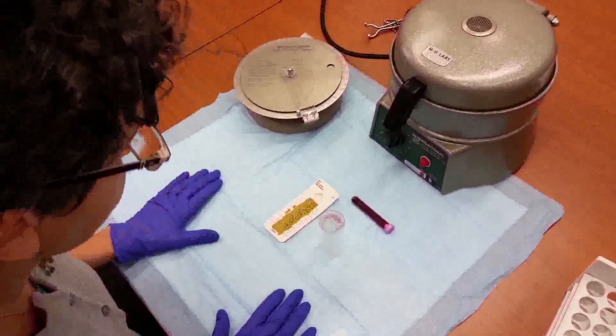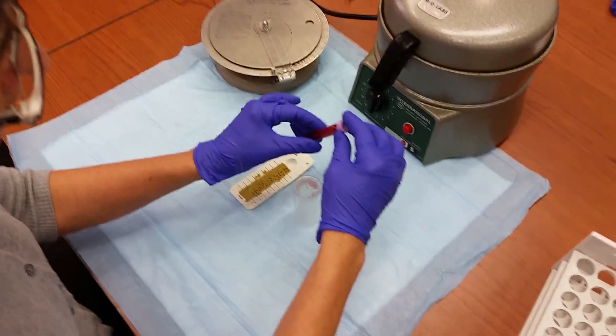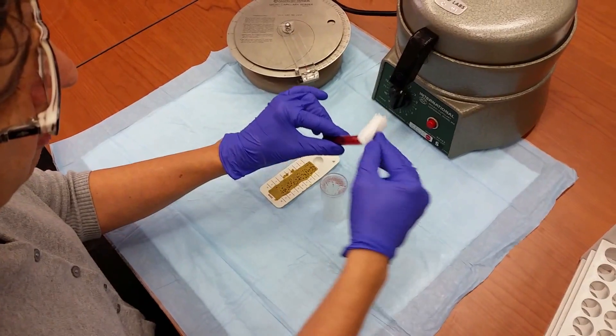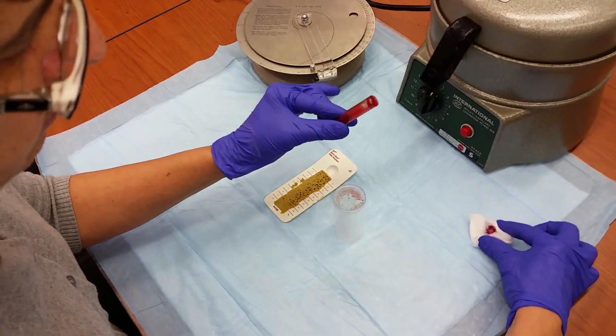I'm going to demonstrate how to spin a microhematocrit. Hematocrit is the proportion of whole blood that's made up by the red blood cells.